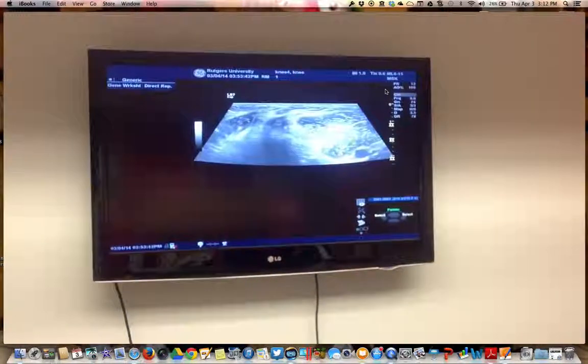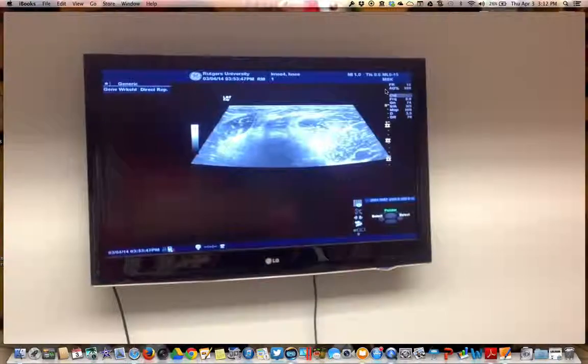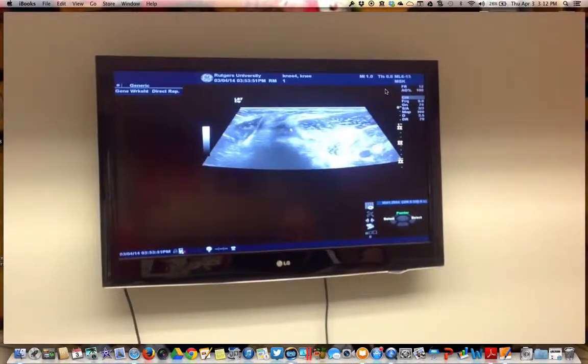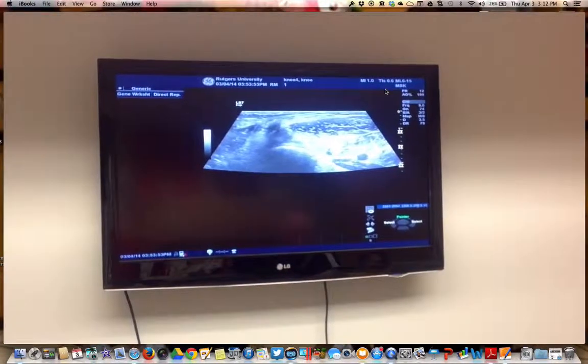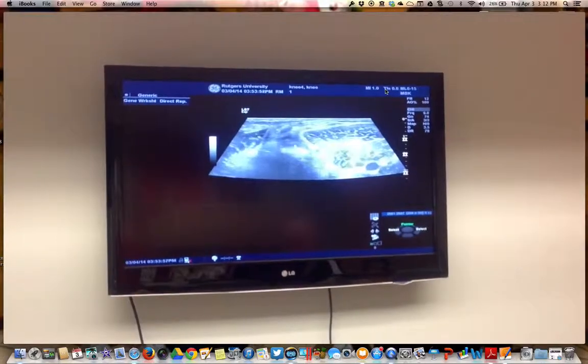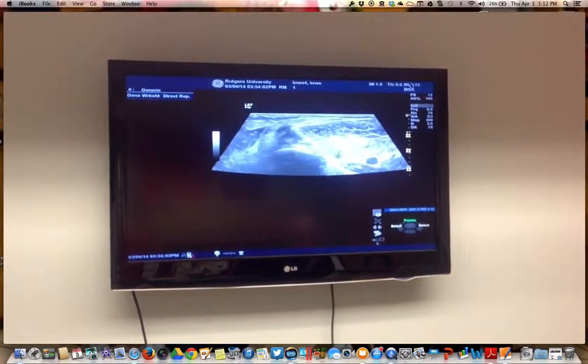The bursa from a Baker's cyst will come between these two and stalk up. We can also follow the semimembranosus down slightly above the condyle here. Again, looking at the medial head of the gastroc and the anisotropic semimembranosus. And this is the zone we want to follow through and look at.